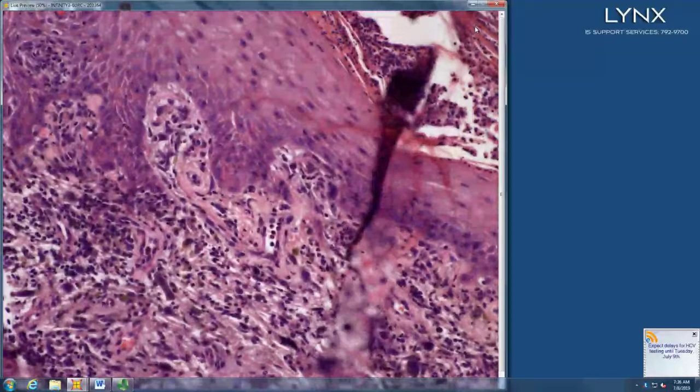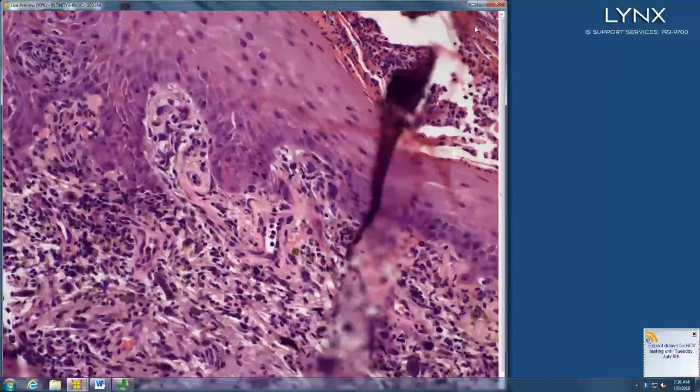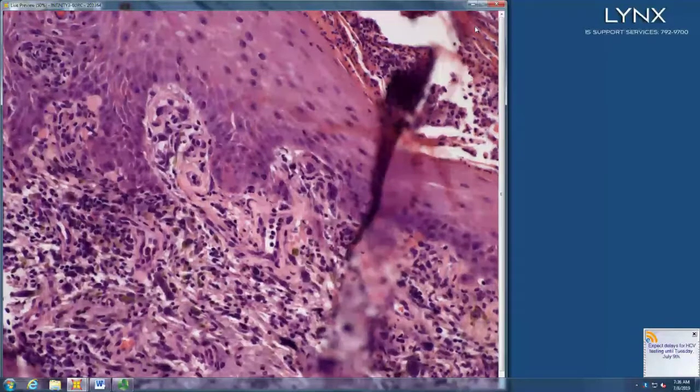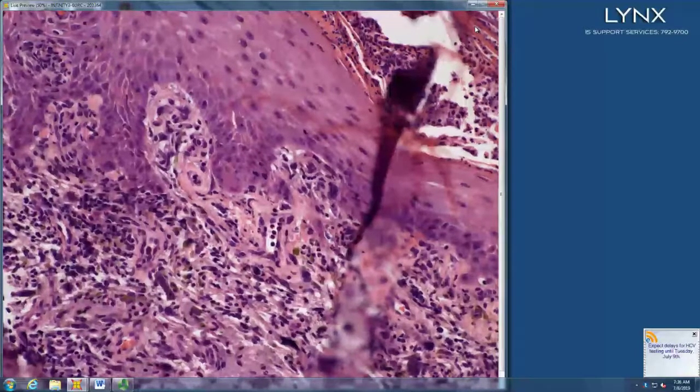So tell me about these atypical spindle cells slammed up against the epidermis. The differential spells SLAM, which is? Squamous cell carcinoma, leiomyosarcoma, AFX, and melanoma. Okay. So do you want to get any stains? Sure, let's do it. Name them.